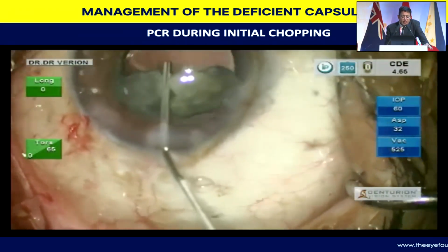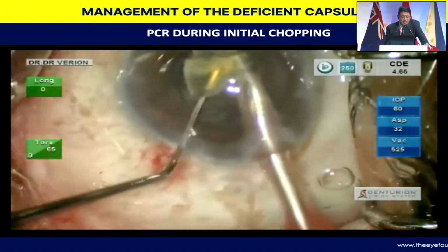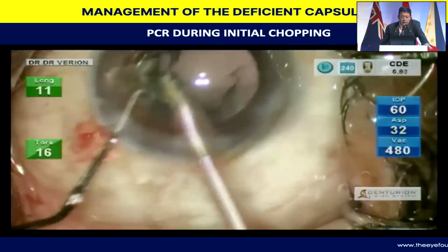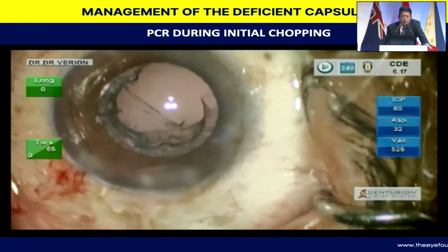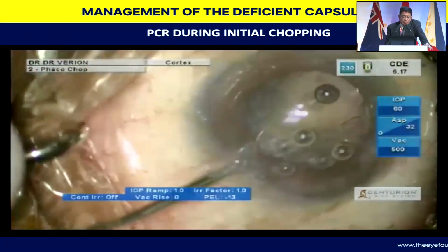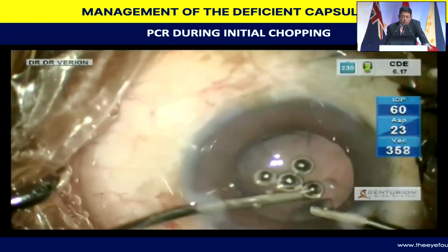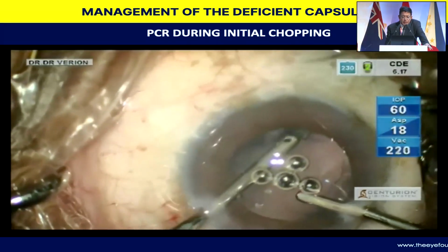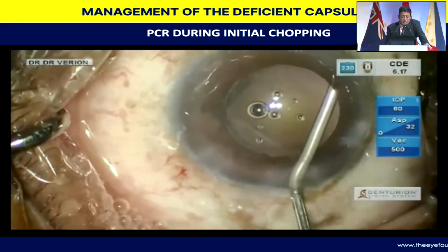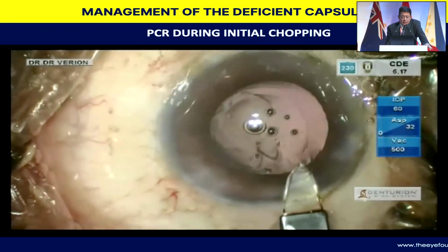You can see the fairly large rent over there, and once again I inject dispersive viscoelastic. The vitreous face is broken, but the idea is to remove as much of the nucleus fragments as possible before I go ahead and do an anterior vitrectomy. And now I do the anterior vitrectomy, where the irrigation cannula is separated, and through the side port, the vitrectomy is done, and then subsequently removal of whatever cortical matter is there. Invariably in these cases, there could be some lens droppings, and at the end of a week, I would always have my vitreoretinal colleague examine these patients to take care of it in case it's necessary surgically, or follow them up closely.